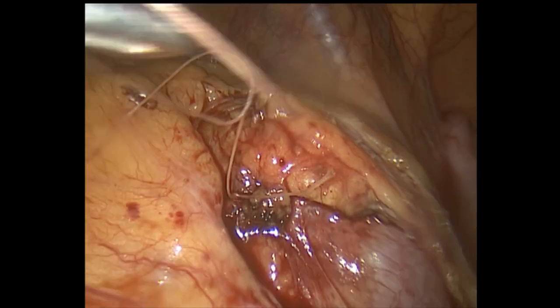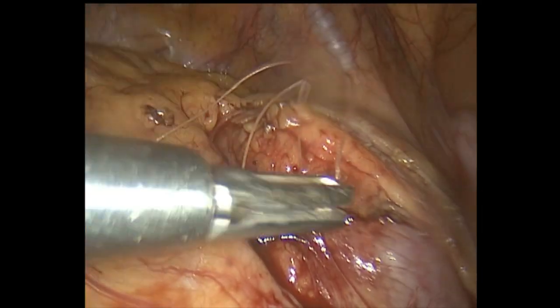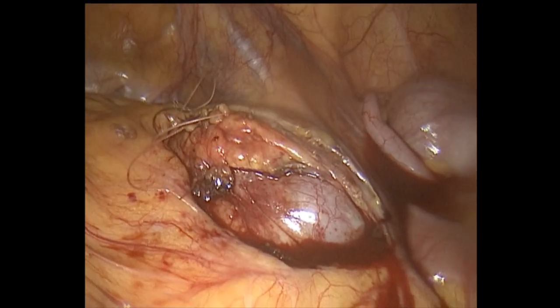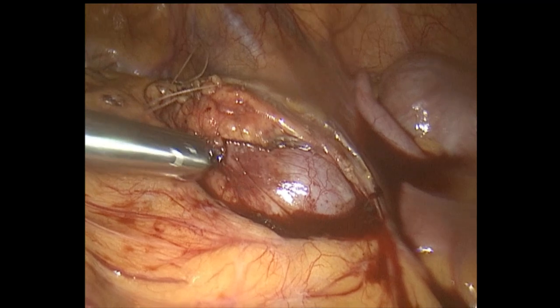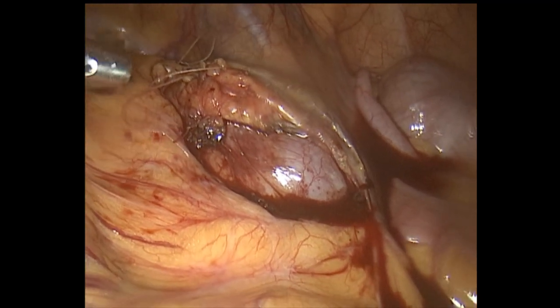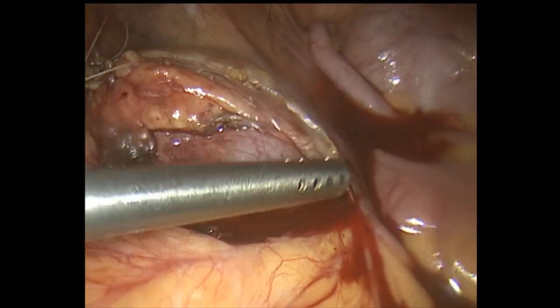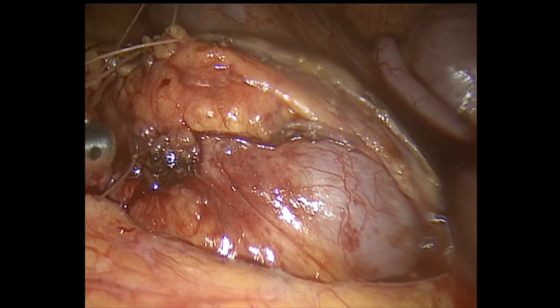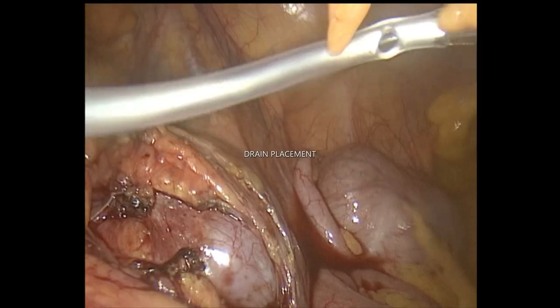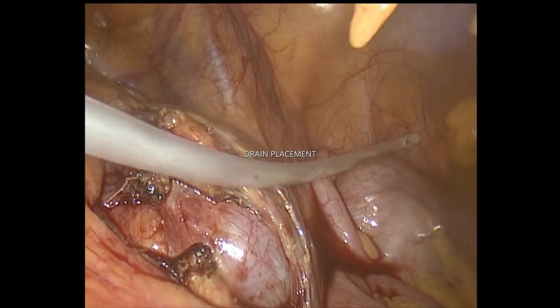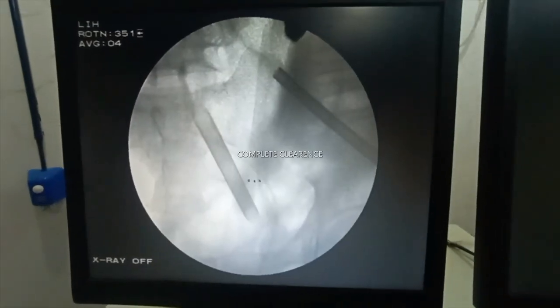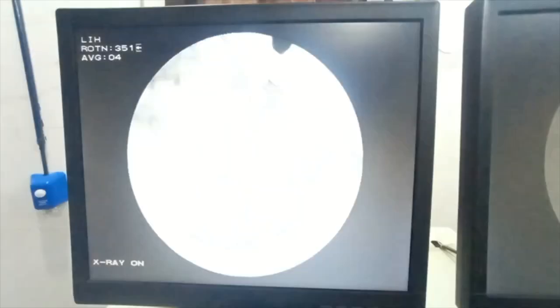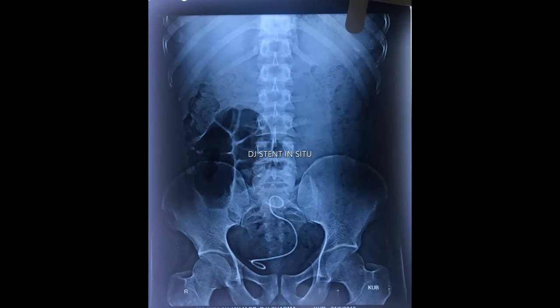After giving the stitch, clear the abdomen and remove any blood or urine present in the peritoneal cavity. The next step after toileting is to place a drain. The drain is placed in the pelvis. This shows complete clearance under fluoroscopy. A DJ stent is placed in the pelvis, followed by postoperative dressing.